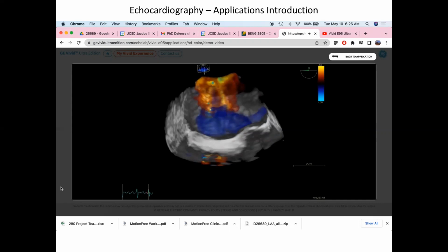It's quite remarkable. When you do flow velocity in MR, which takes, say, 32 beats to acquire the data, you see these coherences in the flow pattern inside the ventricle that must be repeated on every beat in order to add up all that data to get a coherent MR. And so it's pretty impressive how reproducible it is. Yeah. So you cannot do this with atrial fibrillation patients, and you're monitoring the heartbeat, right? So can you time it so that you can sample the QRS? That's right.